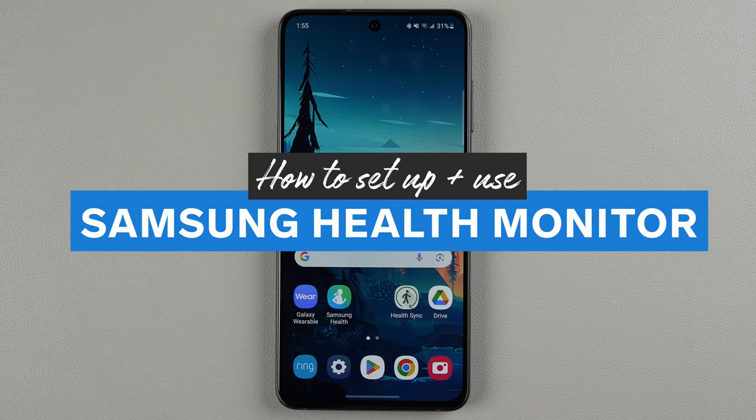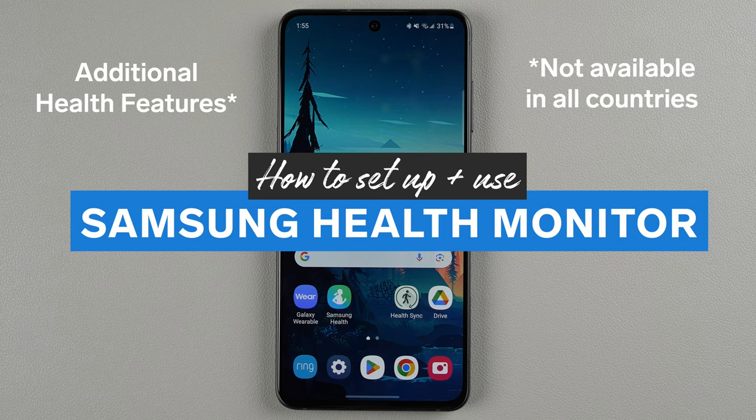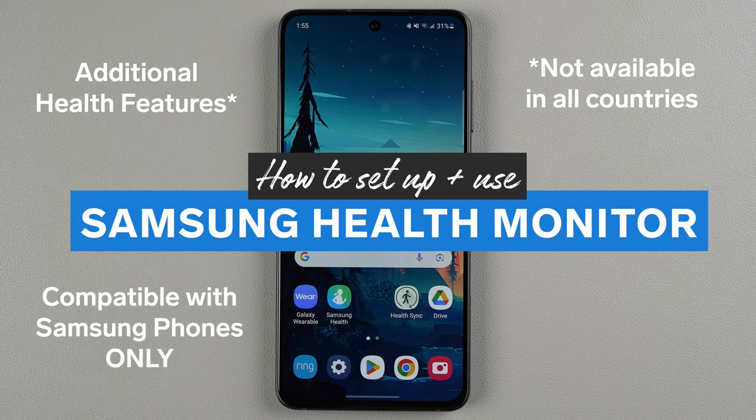In this video I'm going to show you how to set up and use the Samsung Health Monitor app in order to get a few extra health features with your Samsung Galaxy Watch. Just note that this will only work if you have your watch paired to a Samsung phone. It will not work if you have your watch paired to a non-Samsung phone such as a Google Pixel phone.